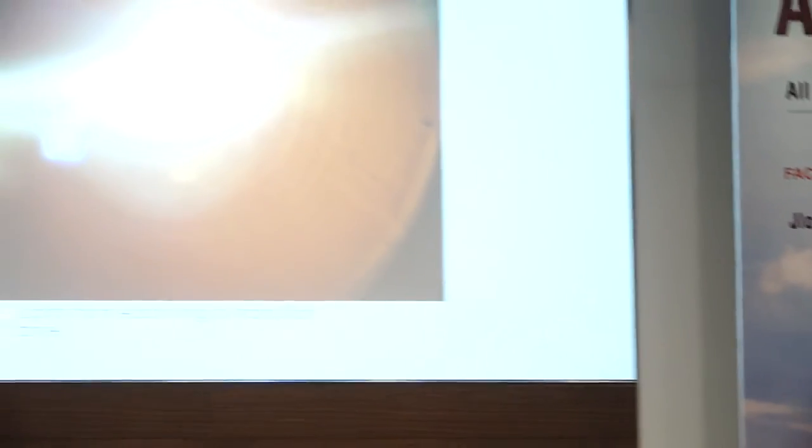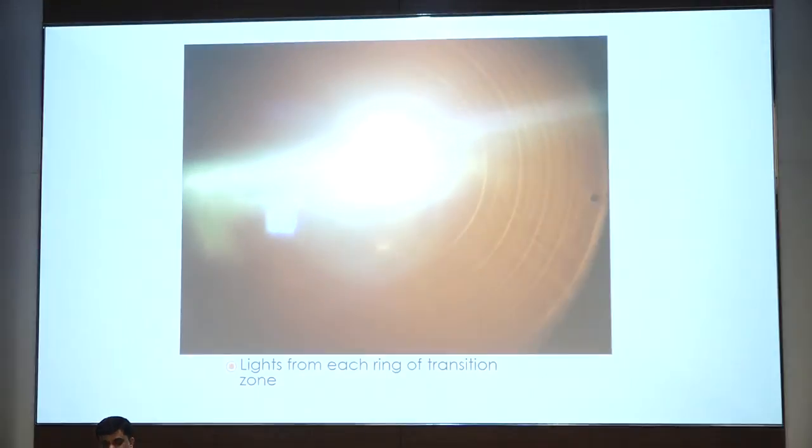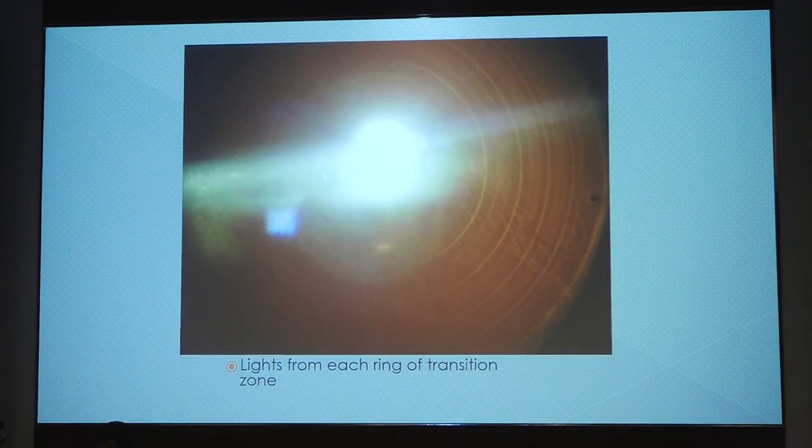Shaman. Going directly to the topic, dysphotopsia is when a patient has very good vision, not only 6-6, but he sees much more. He sees much more light, much more unwanted stuff, and you are happy, he is not. These are expected with any multifocal implant.